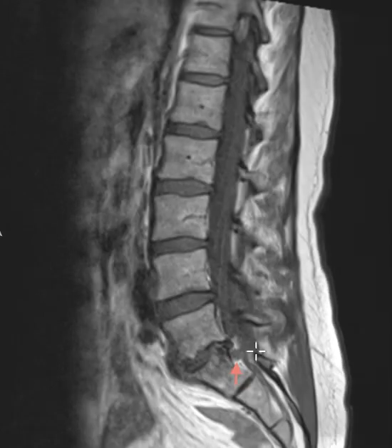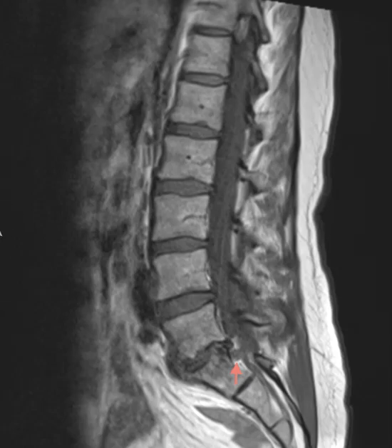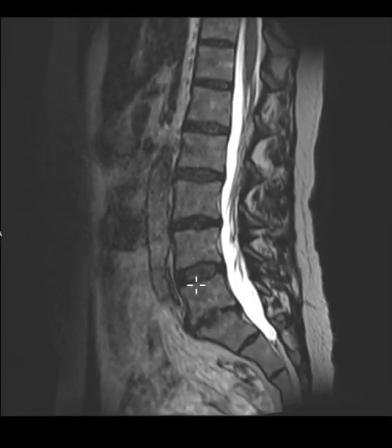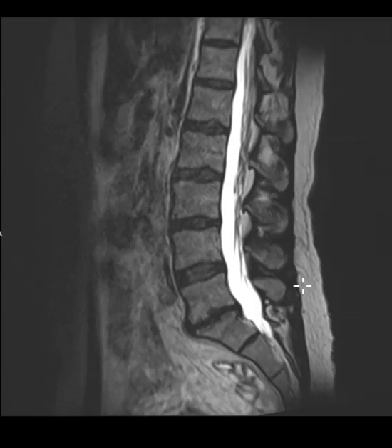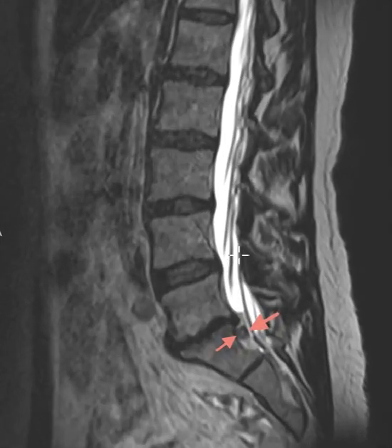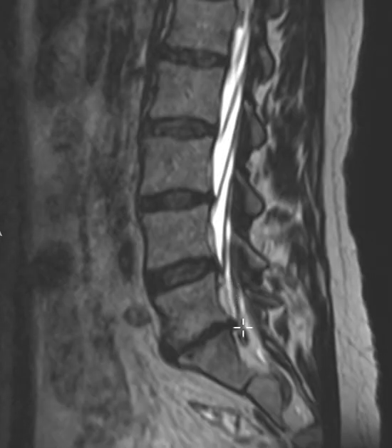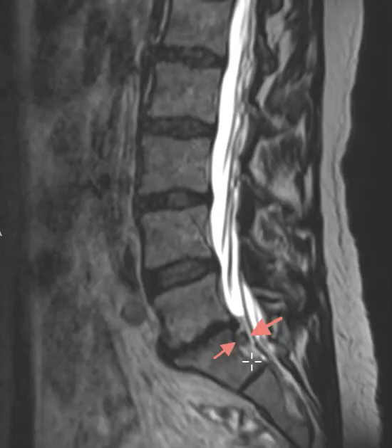It looks like a pebble. So now we're going to go to another view to try to troubleshoot — our sagittal T2-weighted images. In this view, we see the bad disc there, and if we go off towards the right-hand side, we see that little round area. It looks like a little marble, and it's touching this right S1 sciatic nerve, right there.